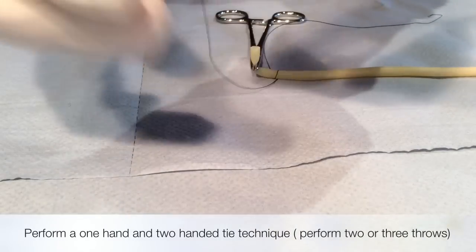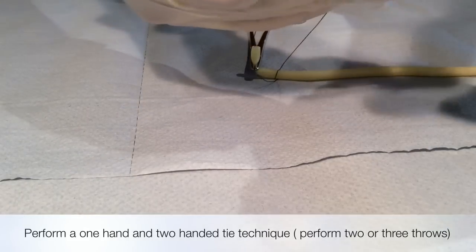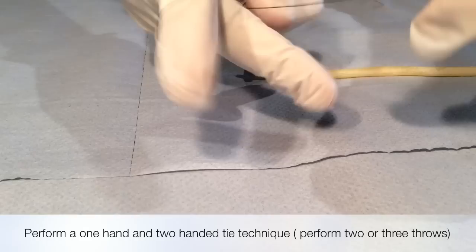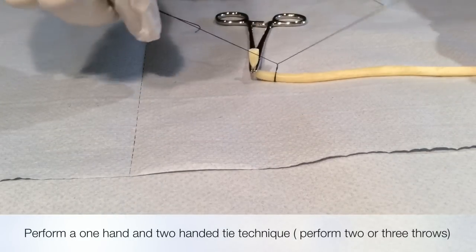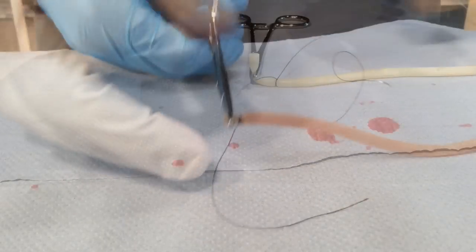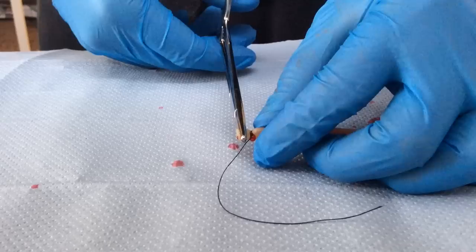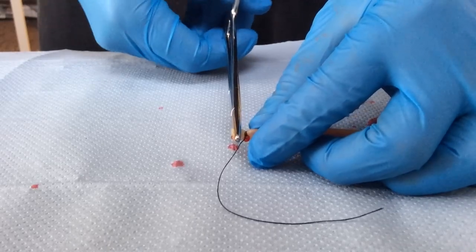You will then need to perform either a one or two handed tie technique. You should aim to do two or three throws to secure the knot. Once you have secured the knot, release the hemostat to see whether you have controlled the hemorrhage.